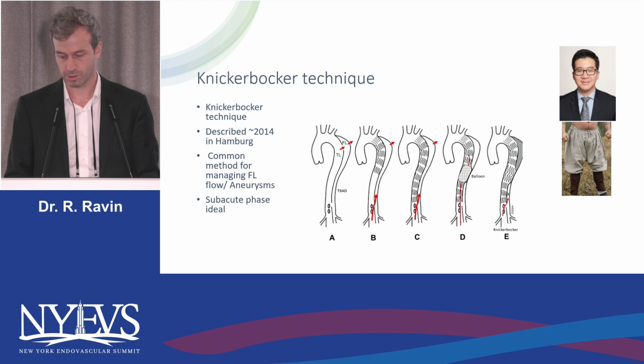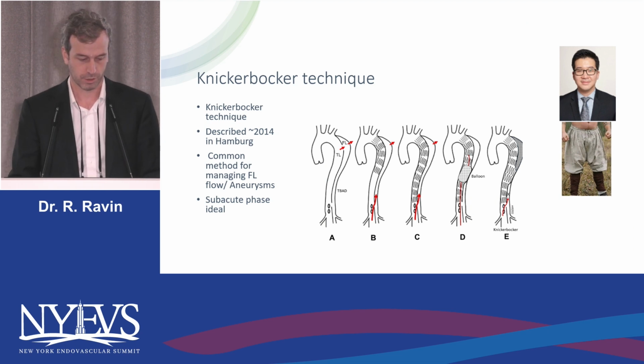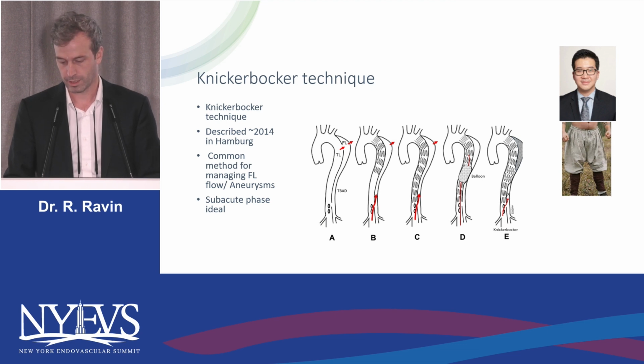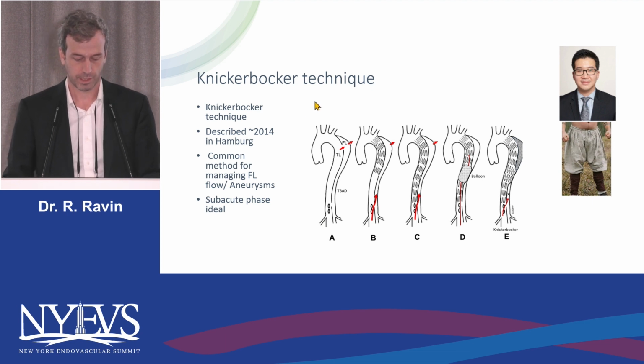But even so, we have options when you have that situation. So the knickerbocker. I have no idea what a knickerbocker really is, but apparently it's this type of pants. I think it's a German thing. I got this picture. I think this was Dan at Oktoberfest showing some midriff. But these are knickerbockers. They kind of flare out in the middle and then cinch down. And this is what we do frequently in our practice.